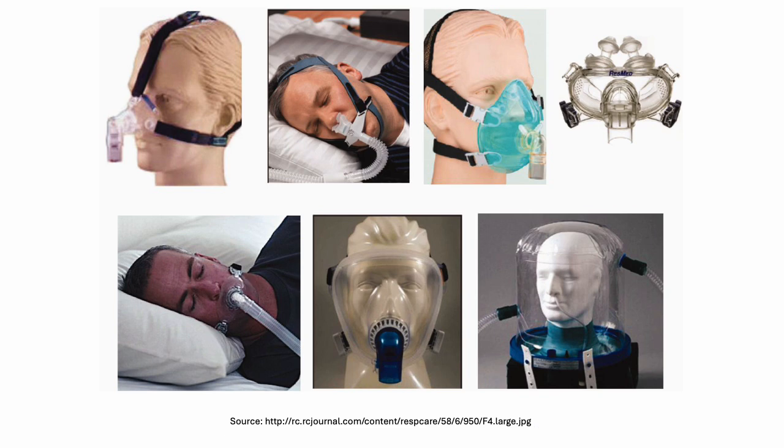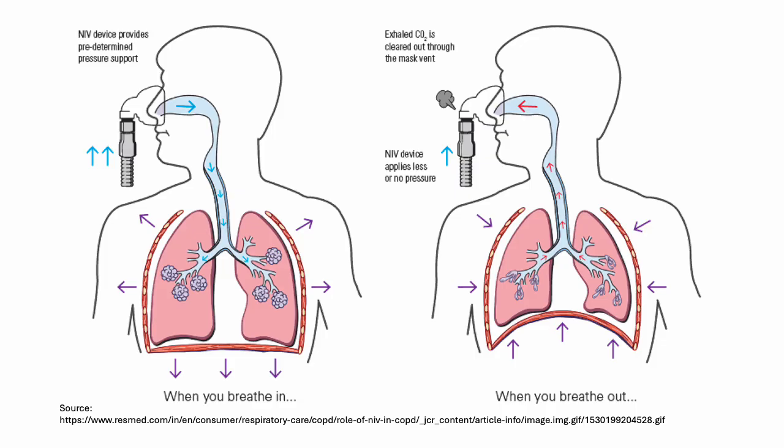Okay, this particular one is hardly ever used, so forget about this. I don't think this is ever used. I don't even know why manufacturers actually produce these kind of masks, because you need to have a full nose block in order to use this. Okay, anyway. So, illustrations of non-invasive ventilation.